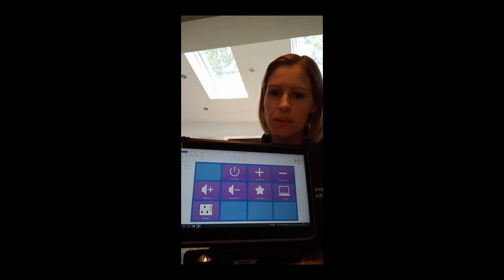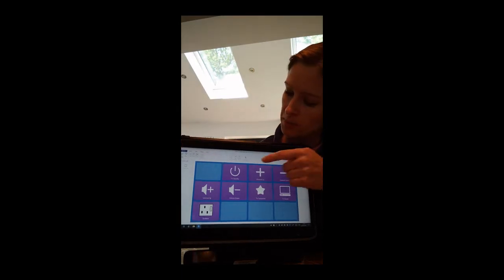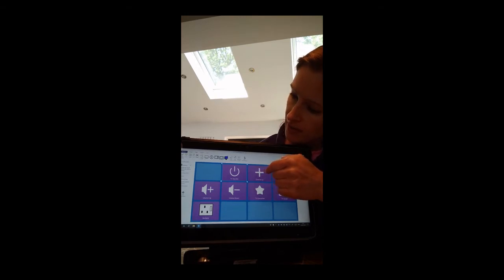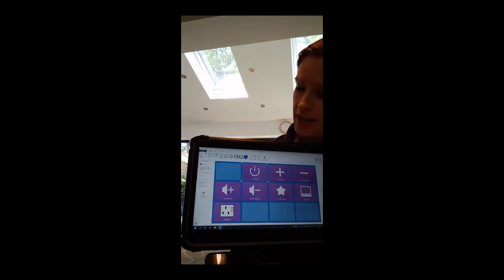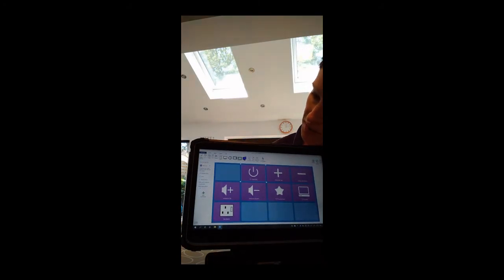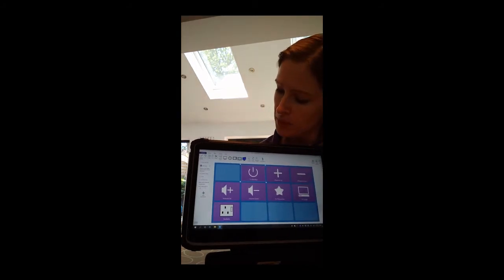First of all we're going to pick the button that we want to start off setting up. On this one here I'm going to go for the power button which is up at the top. So I'm just going to select that button. This will bring up a little menu at the side of the screen, and the button that we want to press is the little red circle that says Learn. I'm going to press on that now.